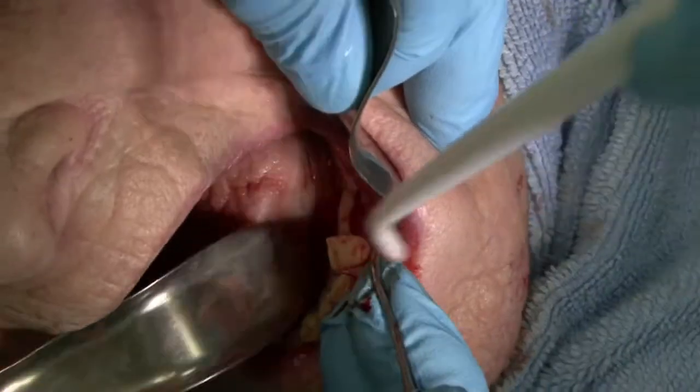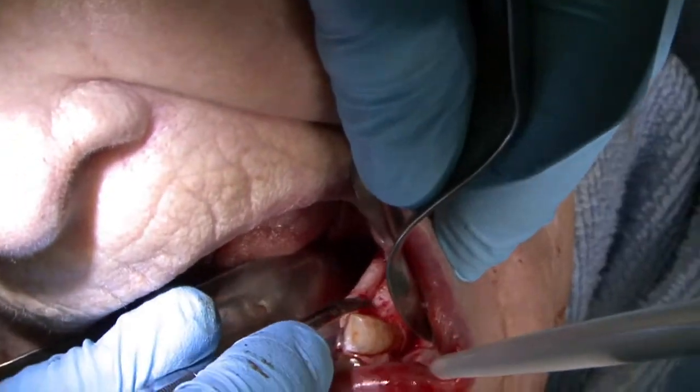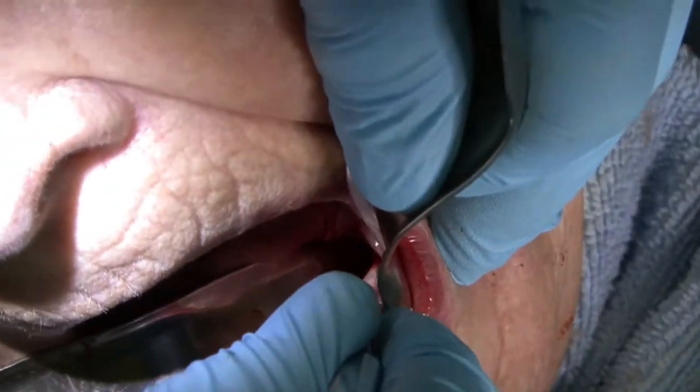Give me the medium size. Sure. There's the hole that's more buccal. There's the alignment drill hole that's a little bit more to the lingual, and we'll go right dead in the middle.